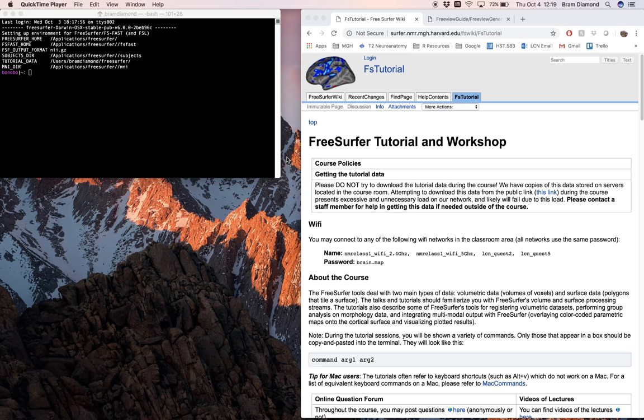My name is Bram, and this is going to be the FreeView demo. In this demo, we will be exploring ways of viewing and inspecting some of the outputs from the Recon All Processing stream.